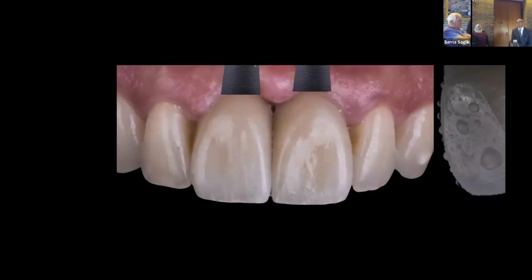When you have two implants close to each other, even though you're 3 or more millimeters apart, trust me, soft tissue is not easy to get. Can I get rid of that black triangle? Absolutely. I can make a long proximal contact. Is that the way it should be? Is this how your body is? No. I am basically making the contact, or I can use pink porcelain. This is not my point.